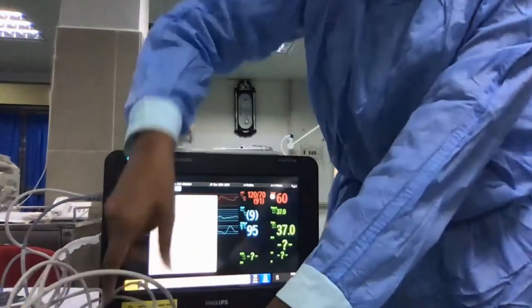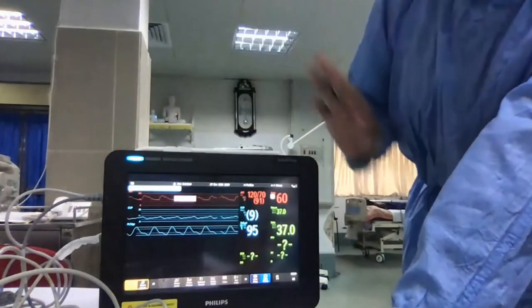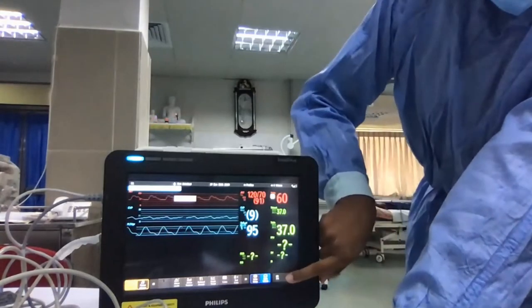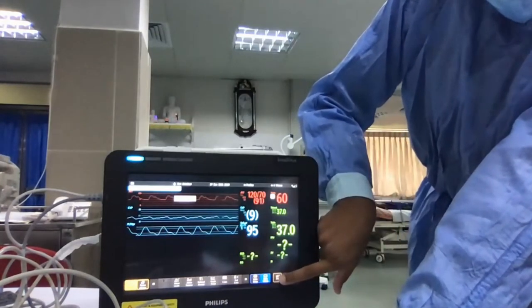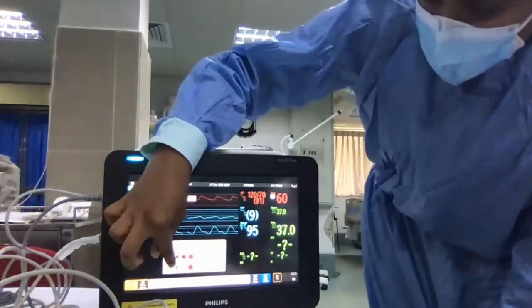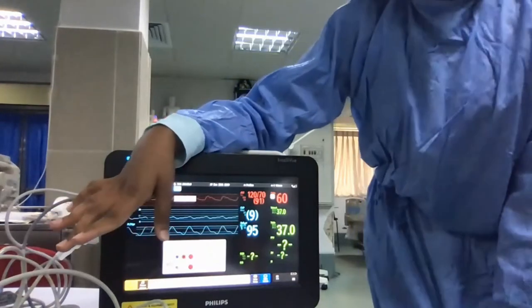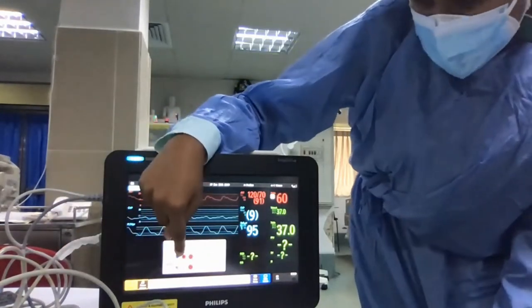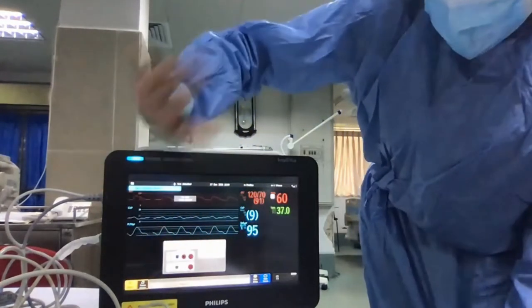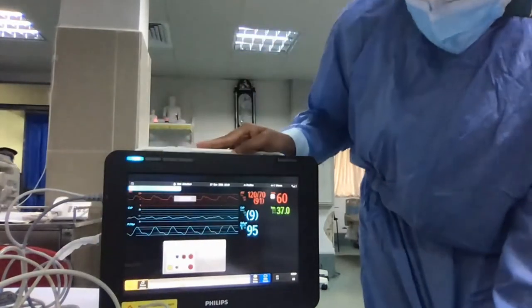Then I will go through how to set it up on the monitor, how to get the PiCCO layout. So this is what we will basically get. Then how to activate PiCCO. The measurement selection I told you, just click on it and you will see a cardiac output port here. Then click on that and see first of all if it is activated or deactivated. In this case, it's already activated. Deactivated means you will see a grayed out port like this. So if it is deactivated, just activate our cardiac output port.